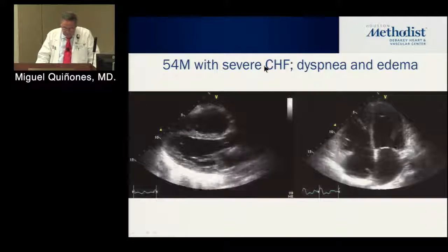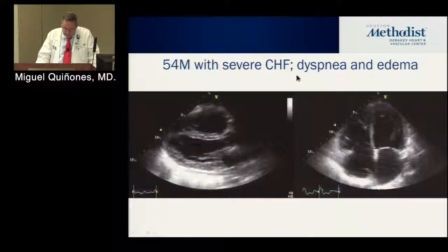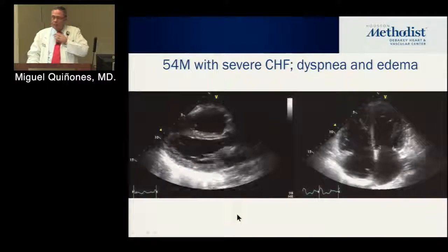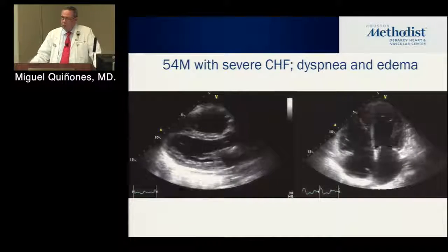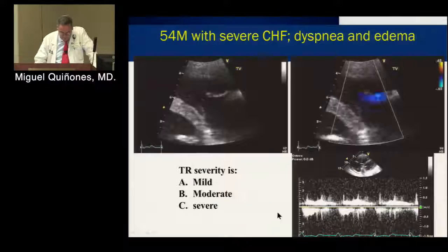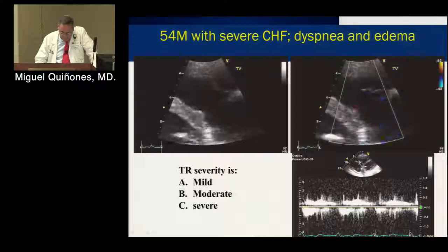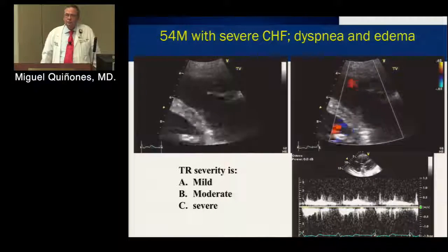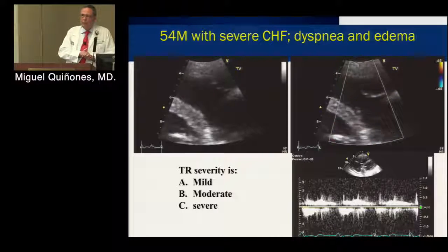And the guy's sick, right? He has all the findings. We see these people, again, not uncommonly, right? They show up in the echo lab, in the clinics. How bad is this TR? Anybody? Who wants to say how bad this TR is?